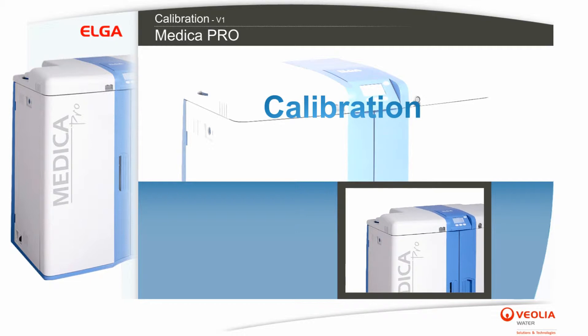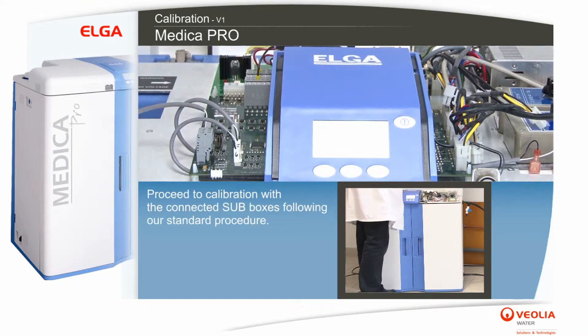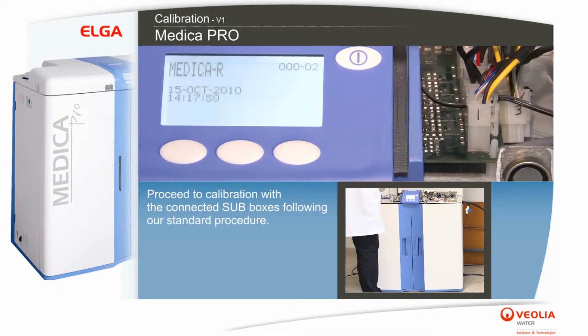Calibration. Open up the cover. Proceed to calibration with the connected sub boxes following the standard procedure.